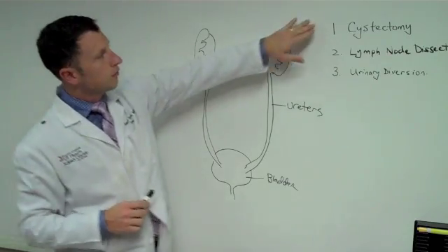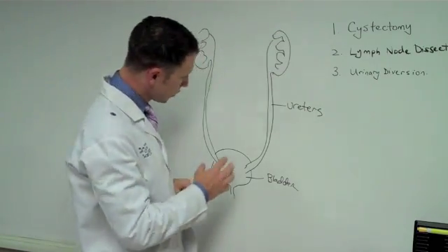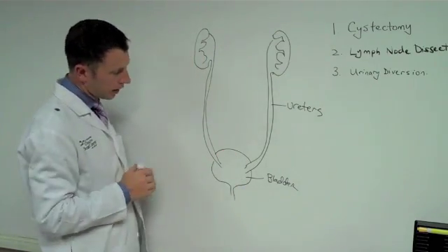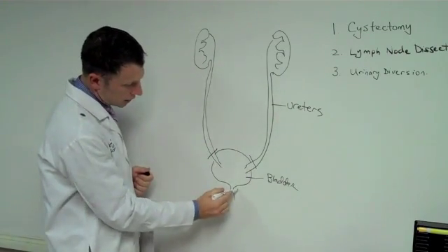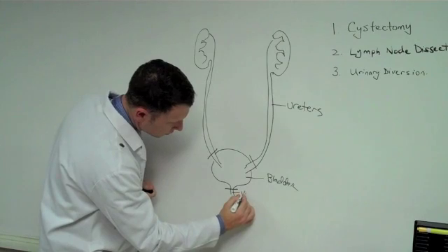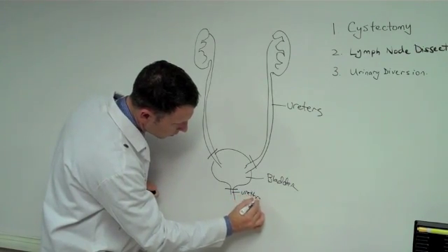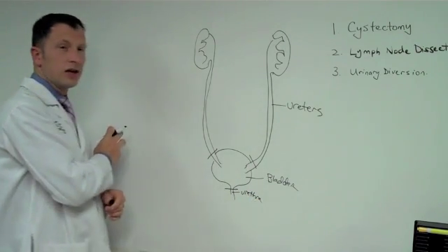So during the first step, which is the cystectomy, we're going to actually remove the bladder here. So we transect the ureters and the urethra. And all of that is then taken out.